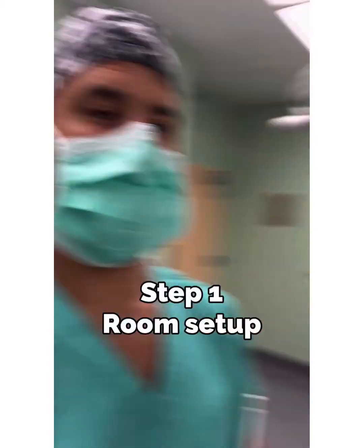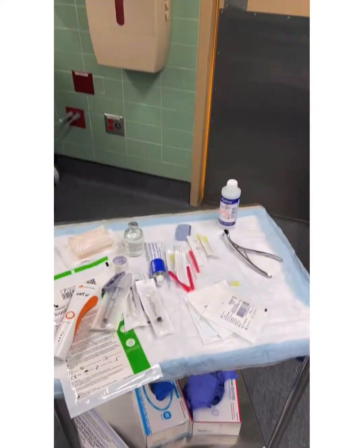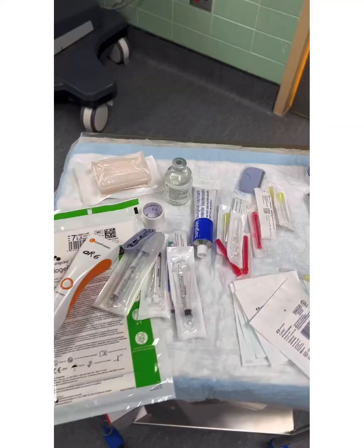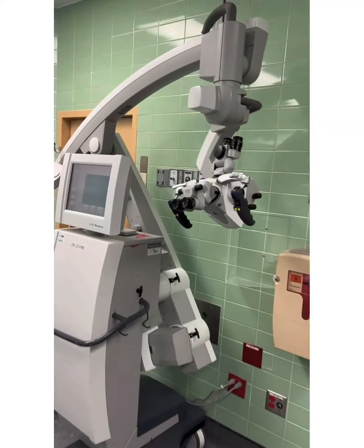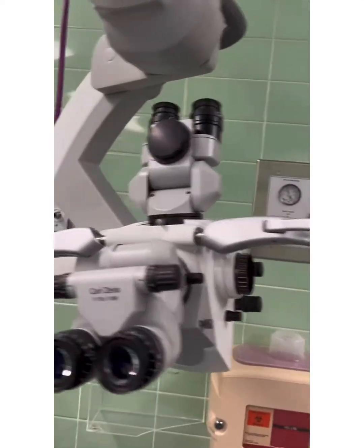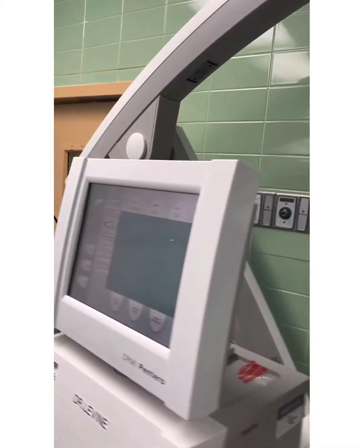We got the patient and the anesthesia team right there. We have our medications that we use for injecting the ear so that there's very little bleeding. We have our very fancy microscope here, which is very expensive and very cool — it's got a monitor, electronic controls, state-of-the-art stuff.